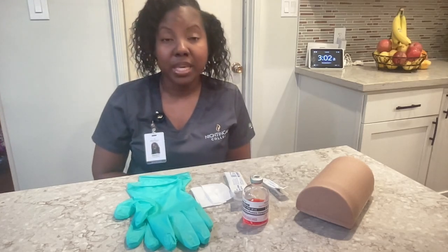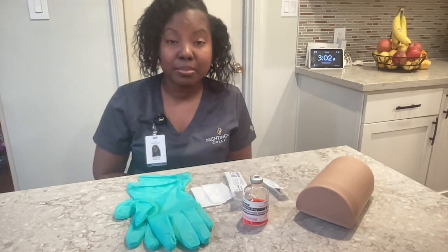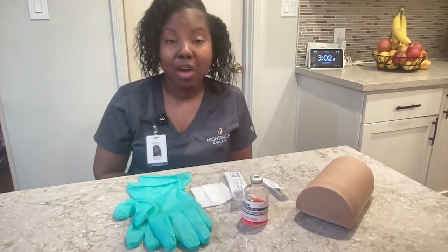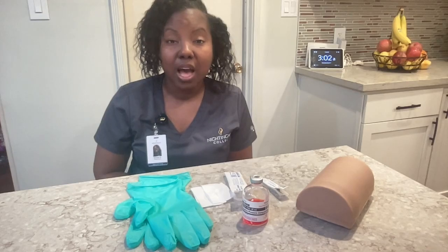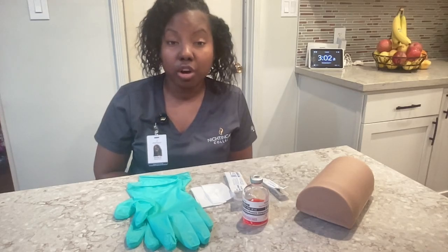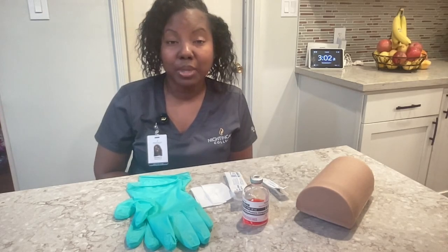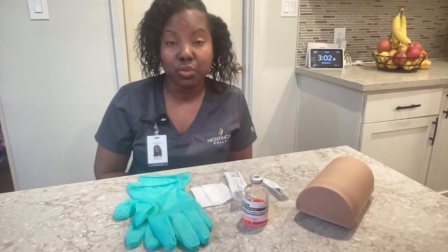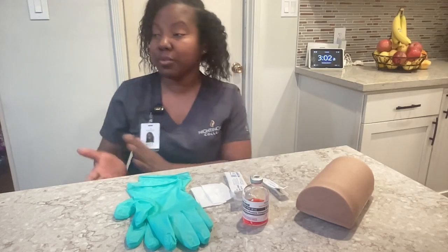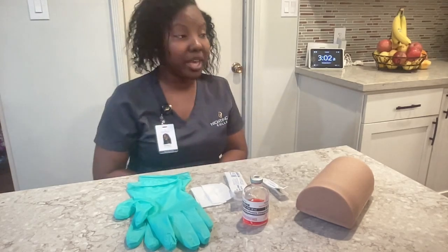I will begin by gathering my supplies. I will proceed to my patient's room. I will knock before entering. I will close the door or curtain behind me to ensure patient privacy. I will place my supplies down on a clean, dry, flat surface. I will perform hand hygiene, and I will proceed with my patient.